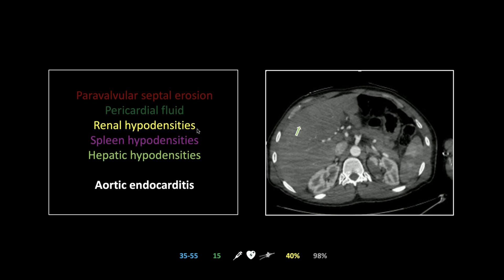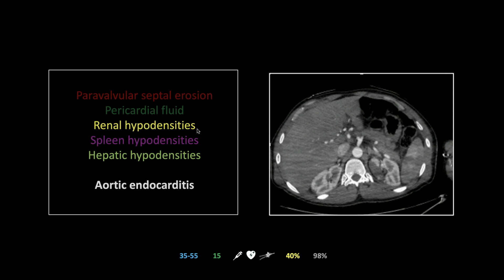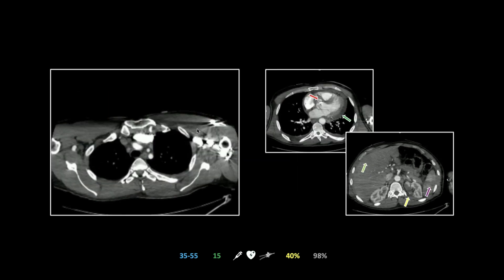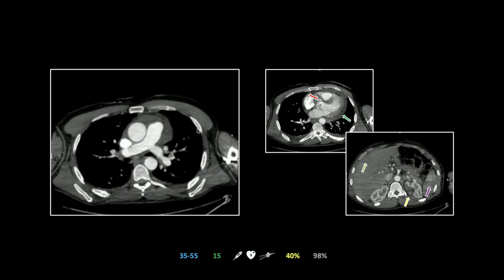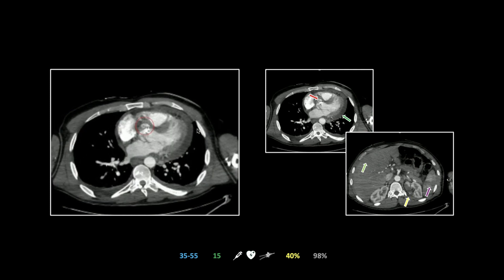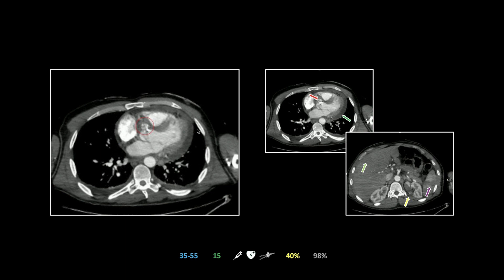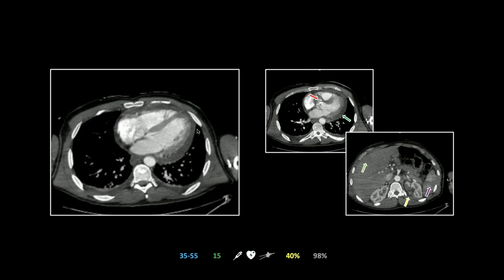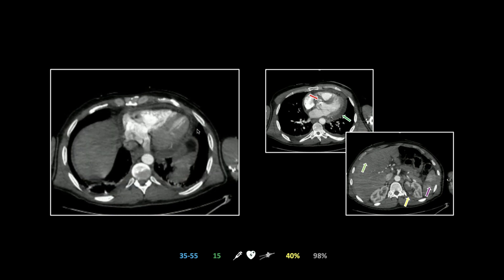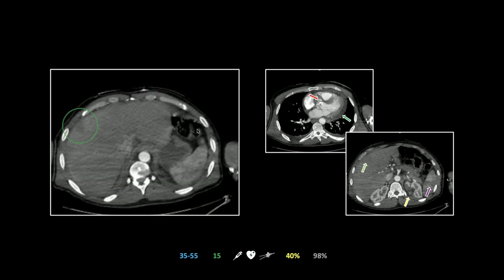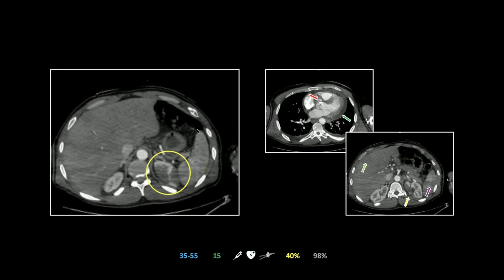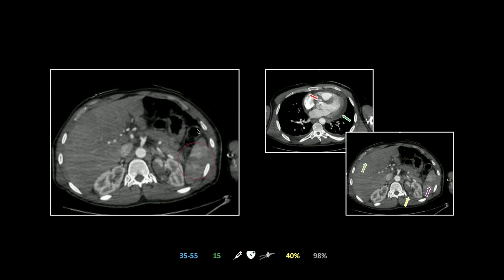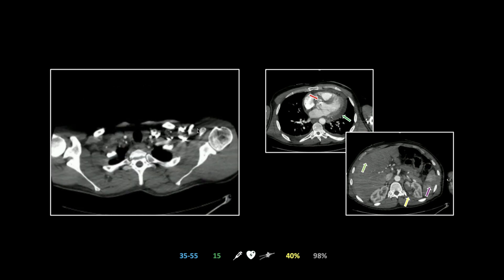These are consistent with microvascular infarcts. Note also what's going on in the liver — it's less apparent in this contrast phase, but there is a wedge-shaped hypodensity there as well. The most important finding is the erosion into the muscular septum adjacent to the aorta — a definitive finding for infectious aortic endocarditis and a risk factor for heart block. The liver, kidney, and spleen hypodensities are also visible.